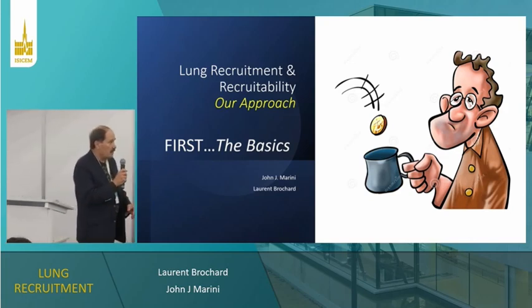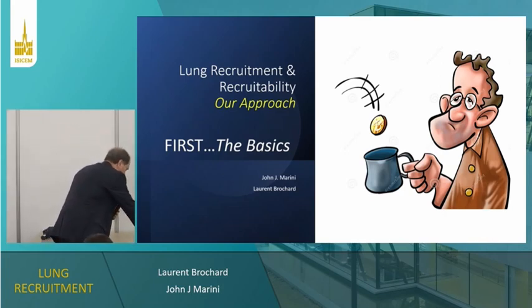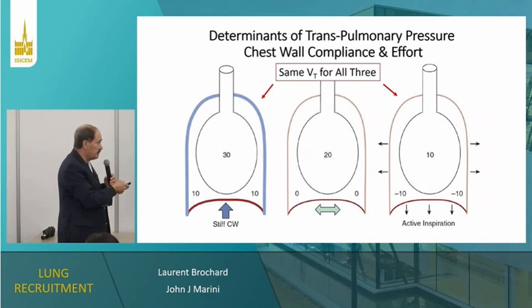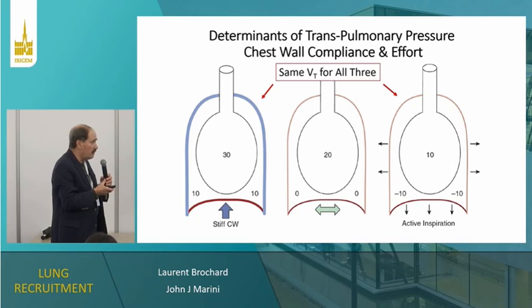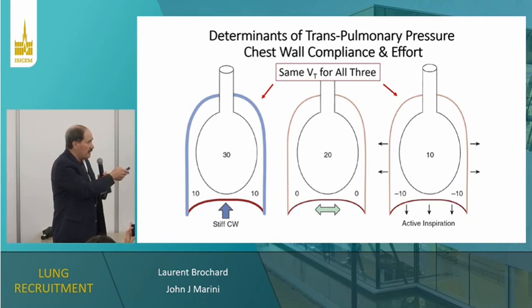That's it, okay. So, lung recruitment and recruitability, our approach. First, we're going to cover the basics. And when I say basics, I mean something that I think all of you understand, but at the bedside is sometimes forgotten, that we measure pressure and volume at one point at the airway opening. And we have the same tidal volume delivered into patients who have a stiff chest wall, a normal chest wall, or active inspiration.